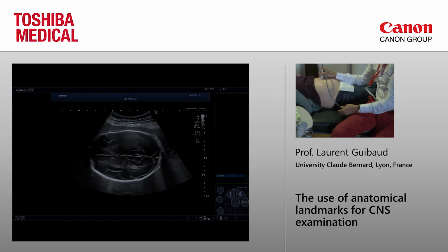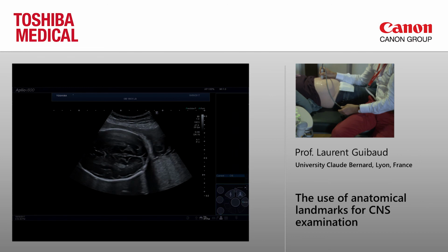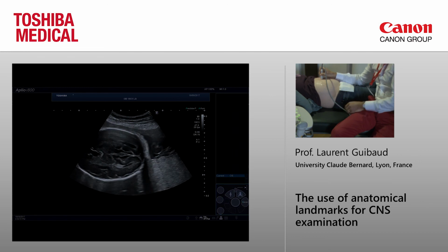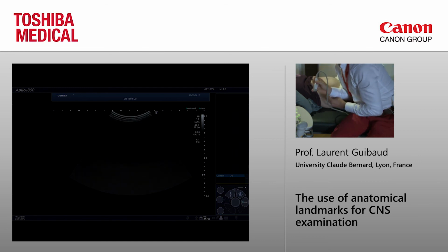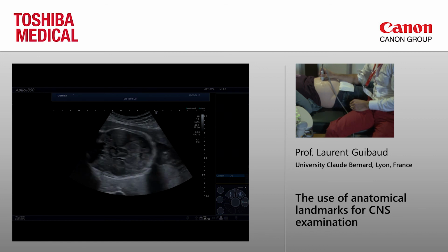Dr. Guibaud? Yes? Could you please show us how you can measure the posterior fossa landmarks in sagittal plane in the suspicion of Blake's pouch?